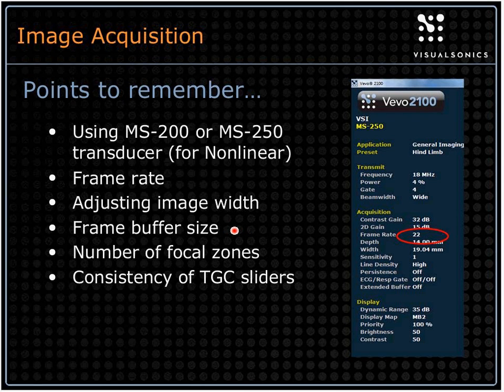This extended buffer adds significantly to the amount of data that you're capturing, so you have to bear that in mind. It may mean more processing, but what it does do is give you a really long run of time to allow for data to really accrue in the buffer, and for hopefully the bubbles that you've injected to come up to a constant circulating level of perfusion.